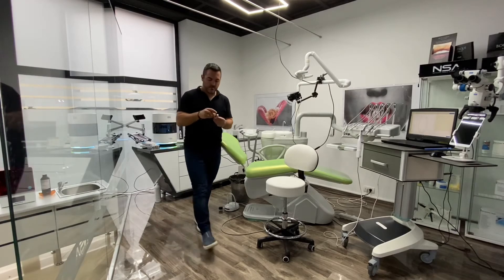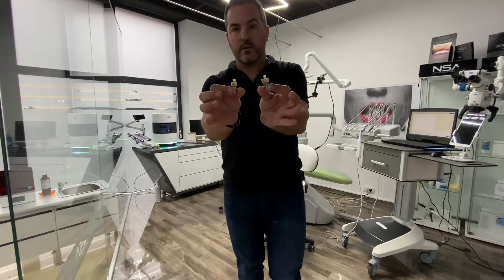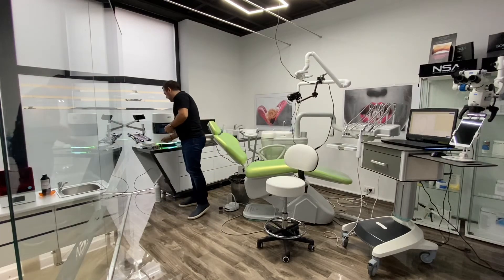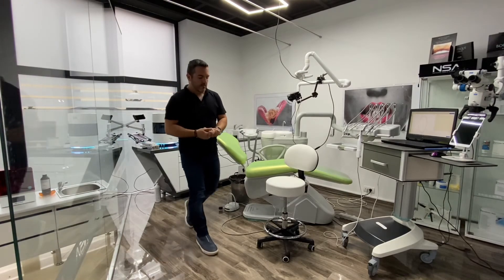You can mill your own veneers in the office with a chairside mill — this is my chairside milling option for the dental office. Just glaze them and cement them into your patient's mouth. Chairside dentistry is at this moment perfect; it doesn't have any missing links anymore. I really recommend you start working digital — analog is history. Digital dentistry is extremely powerful, extremely predictable, and I really recommend you use it every day.